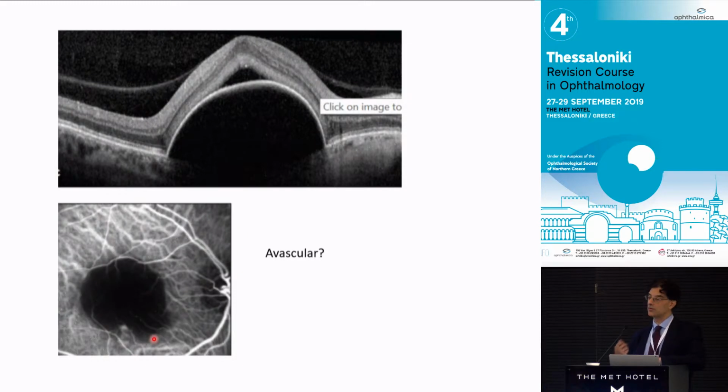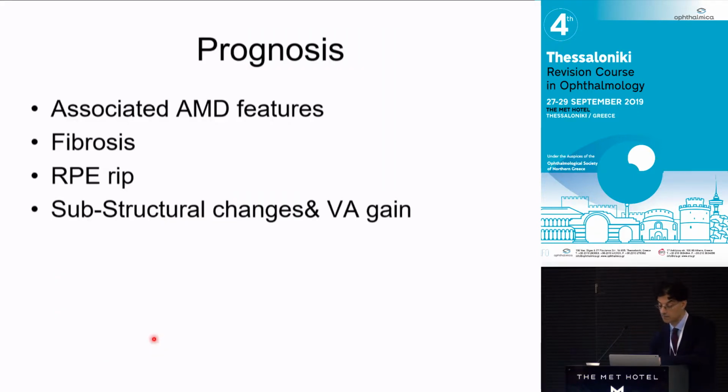So the danger with looking at single slice OCTs is it's very easy to miss things, and we're very attuned to looking at things en face. So you need to try and look at en face if you have access to it, be very disciplined, and think about the patient's symptoms of the sudden change, and should you do additional tests.